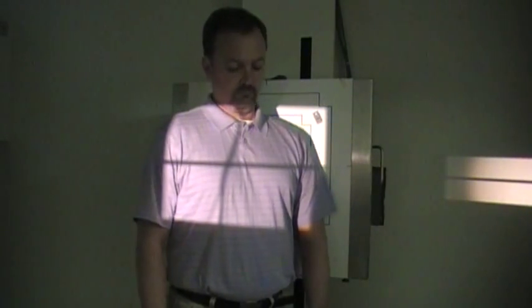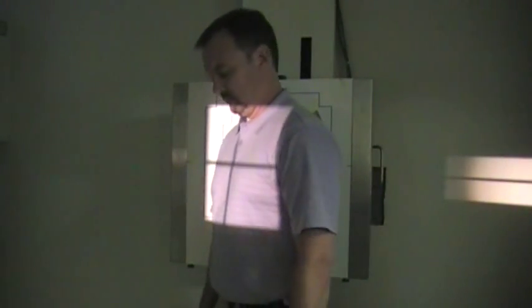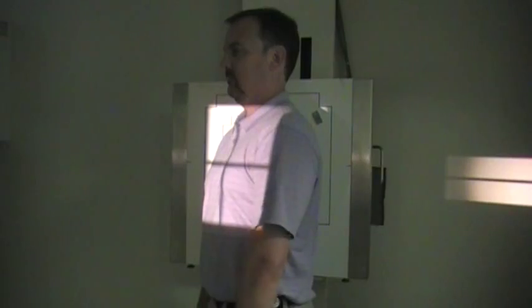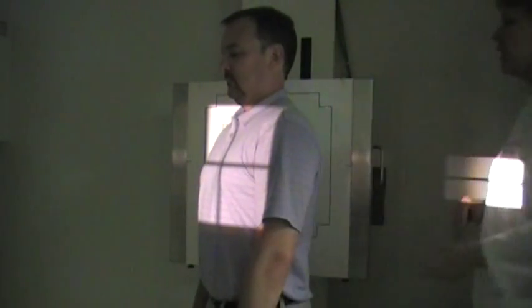So with your chest oblique, being this is the left oblique, you're going to use your left marker to mark the side touching. You're going to ask the patient also to do this on deep inspiration. So again, we're going to ask them to take in 2 deep breaths and then hold that.